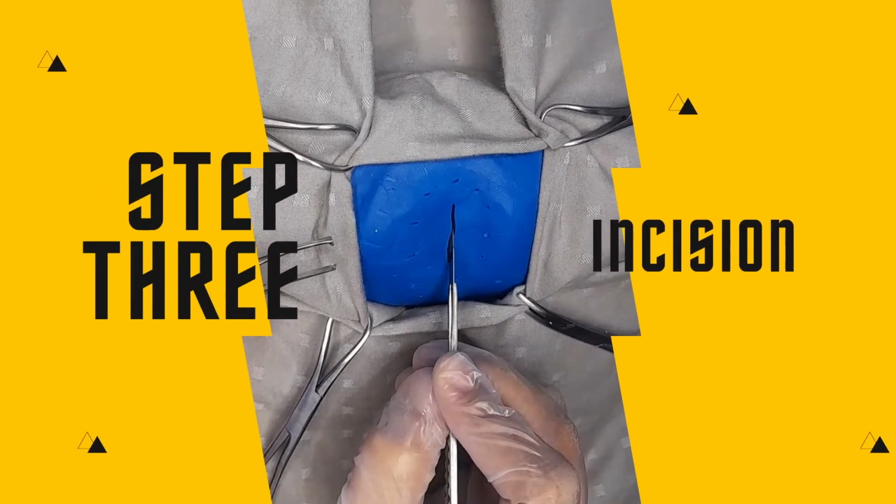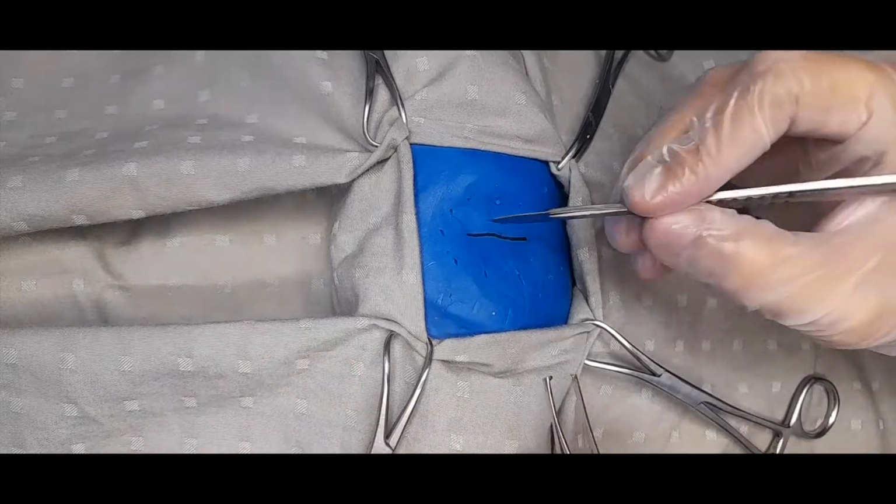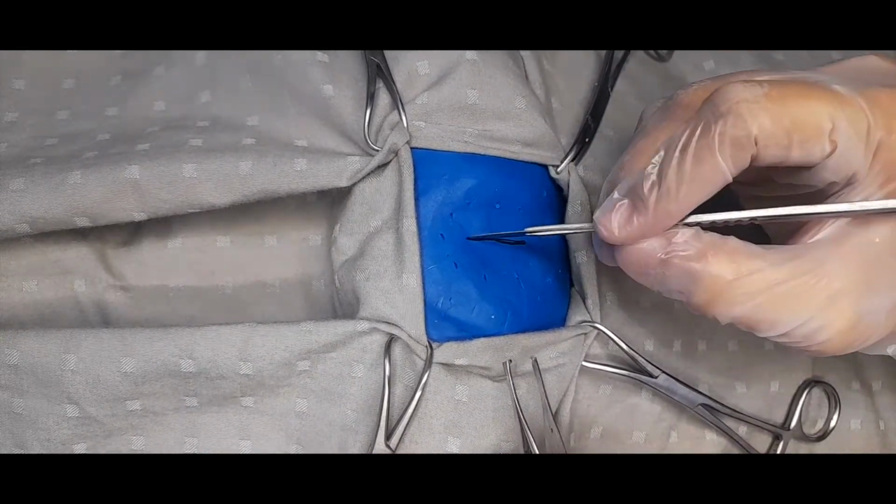Step 3. Incision. Make a horizontal incision along the marked line through the dermis.